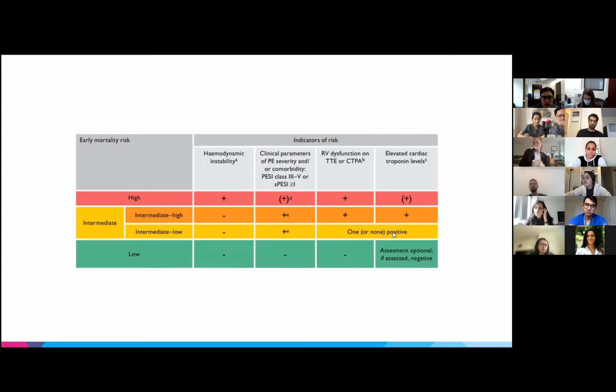The main way we delineate that is by using the cardiac biomarkers and the RV function on imaging. And it's important: the CT tends to overread. It's overly sensitive at reading RV enlargement, and a lot of times when we do the echo, the RV is actually normal. So it's important, if you can, to do at least a bedside echo to better assess what's going on with the right ventricle, because unfortunately the echo techs are not available 24 hours a day, so we have to see what we can do ourselves.